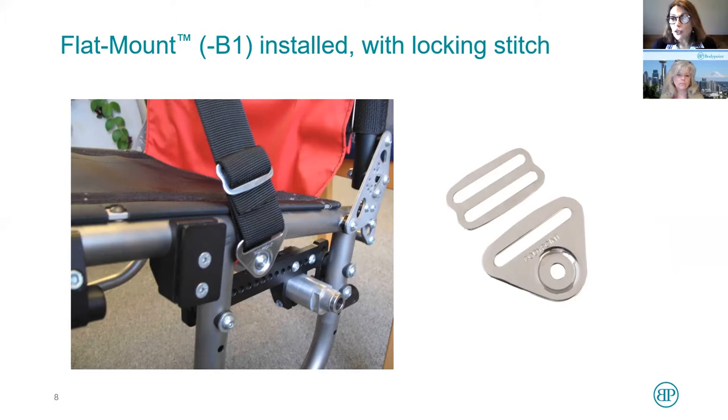Here's a flat mount attached to a wheelchair. You notice that the webbing is threaded through — it threads through the three-bar slide, through the flat mount, and comes back up. But it takes a final pass of the webbing to thread back through in what we call the locking stitch. If you do that, we know that this will pass the ISO standards testing for postural supports, so the client will be perfectly secured in their wheelchair.